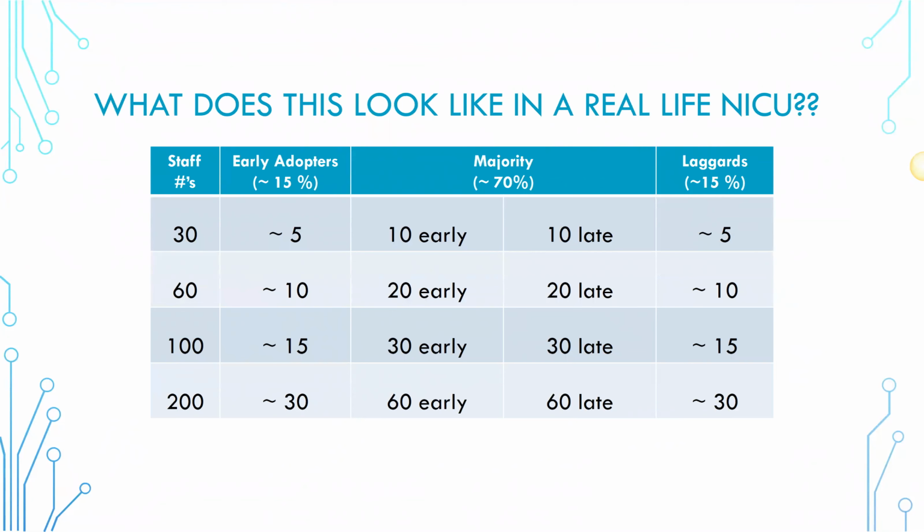Maybe one of your quality indicators is how quick you get your aEEG monitor on. So thinking about that time to application after admission. So are you tracking that? Could you do better? How about the timing of review and reporting? How's that going? Do you have a way of looking at who's been reading it? Do people document on the tracing when they've done a review? Our neurology colleagues do. Maybe we should do that too. Are we doing reporting? How often is it getting in the record?